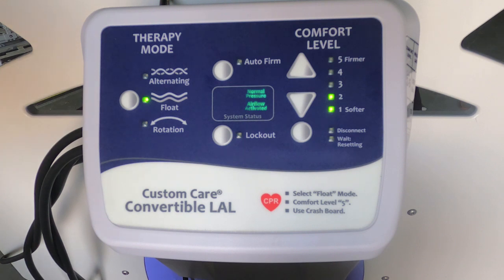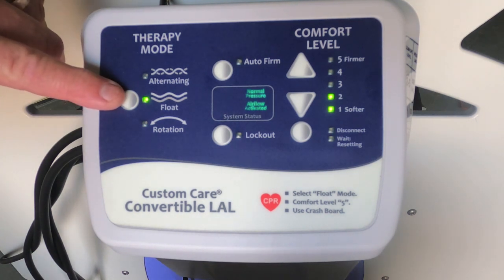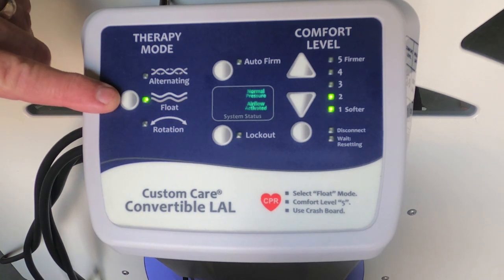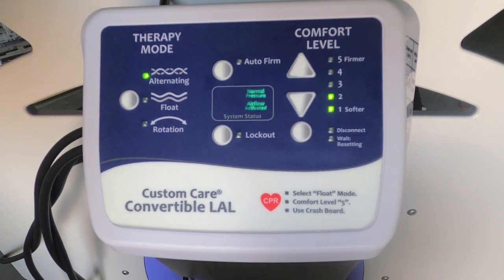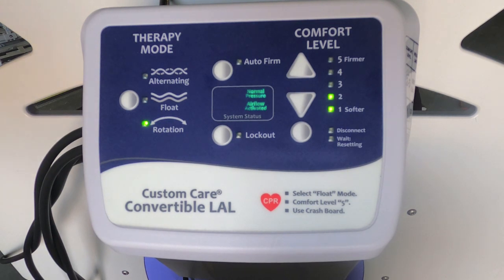So the first thing you want to do with the setup of the system is to choose the mode of therapy you wish to use. In the float mode, the surface is uniform, it's not rotating or alternating, it's just a uniform pressure managing surface. If we push the button again, it goes up to alternating, and alternating pressure is provided on a cycle time of 15 minutes. Rotation, also a 15-minute cycle. One thing that's important is if you're in the rotation mode, make sure that the head of the bed is not elevated above 30 degrees. It can create some issues that we'll talk about later.